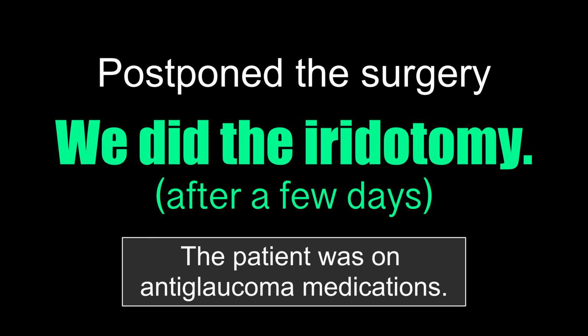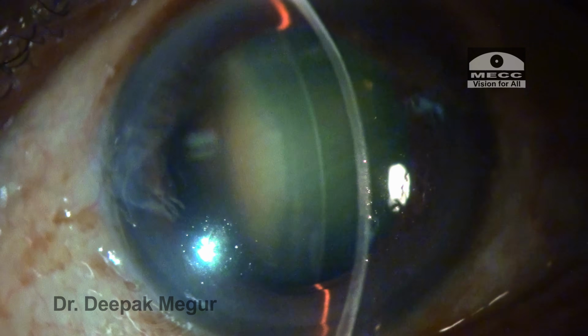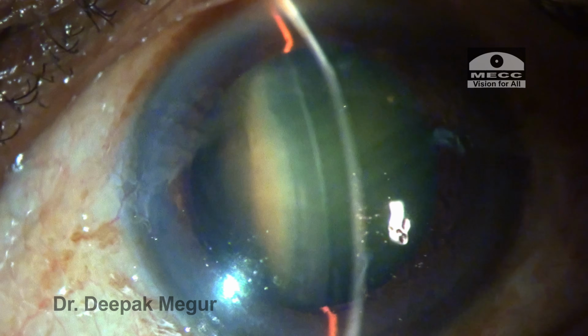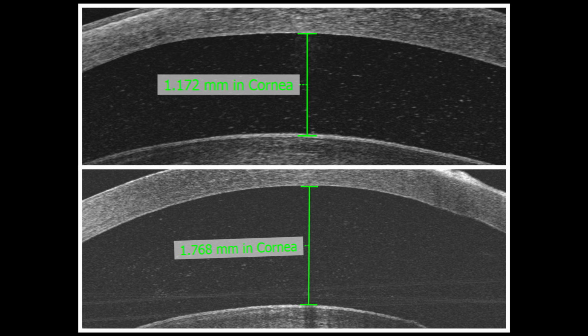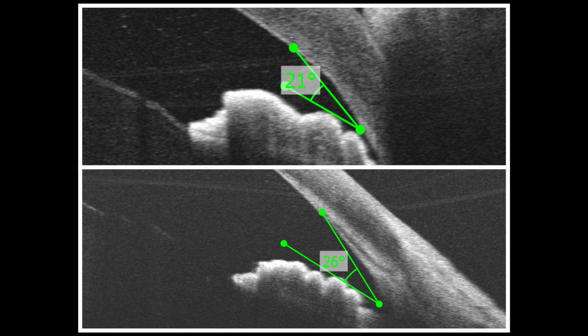The pressures were normal. We rescheduled the surgery again after 1 week of laser iridotomy, and this is the slit lamp picture on that particular day. The chamber is relatively better, but still it is shallow. I can still see that the lens appears to be bulging forward, and the distance between the iris and the cornea seems to be much more than what it was before doing the iridotomy. On retroillumination, this is how the iridotomy looks like, and it is patent. We did the anterior segment OCT and the angle assessment post-iridotomy. The chamber depth had significantly increased by around 600 microns, and also there is a significant improvement in the angle opening. So let's begin the surgery.